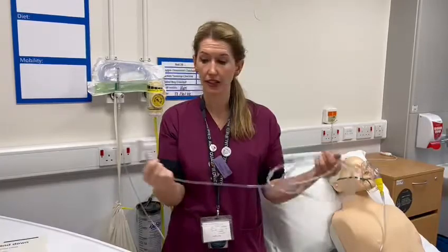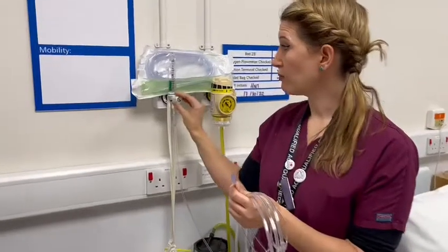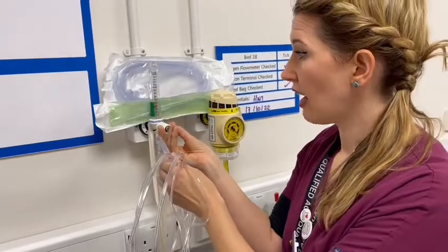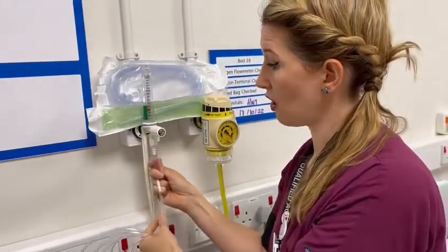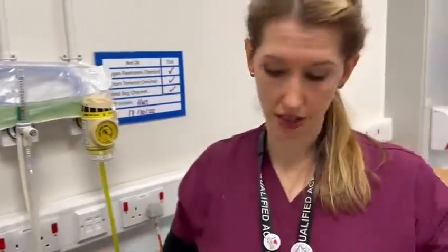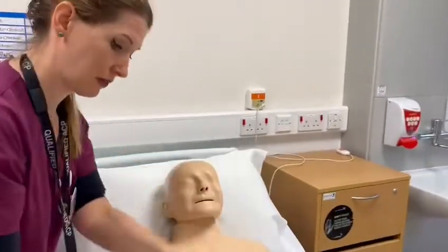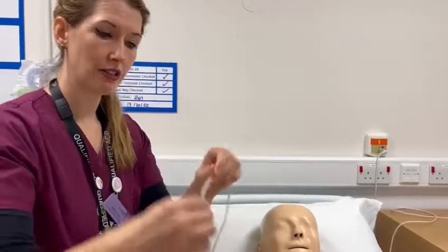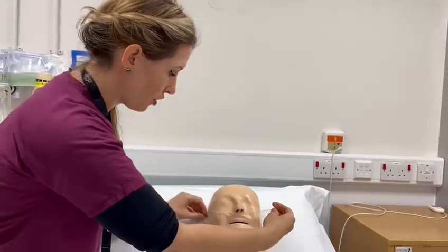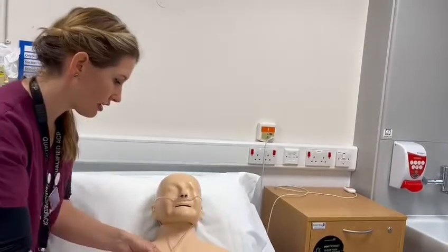Open it from your packet, and I am going to explain to my patient what we're going to do. And what I will do is I'll come to my flow rate here. I will reduce that down to 4 litres, and I will then remove this and switch and push hard on with the nasal cannula. I will then come to my patient, explain to them that I'm going to change over the nasal cannula, remove the mask, and the way this works is it'll see that it curls up into the nostrils. So I tend to hook it up into the nostrils, hook behind the ears, there we go, and then just tighten it under the chin.